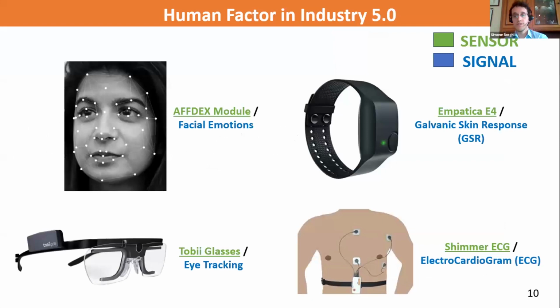To do this, it is crucial to monitor the psychophysiological state in real time using modern biosensors, aiming to collect high-quality data signals to classify and possibly predict stress states or other psychophysiological conditions, such as physical fatigue or cognitive workload.